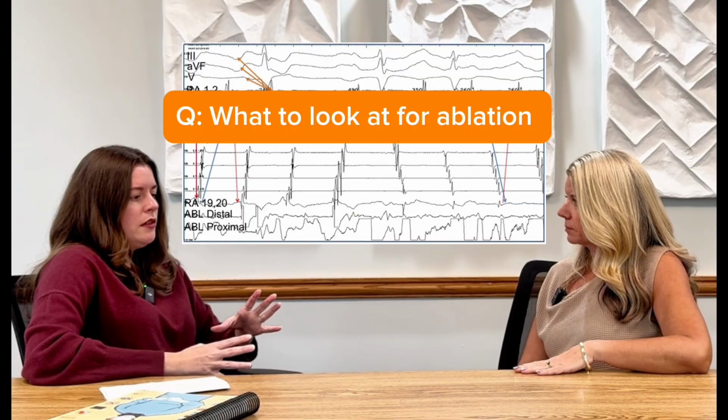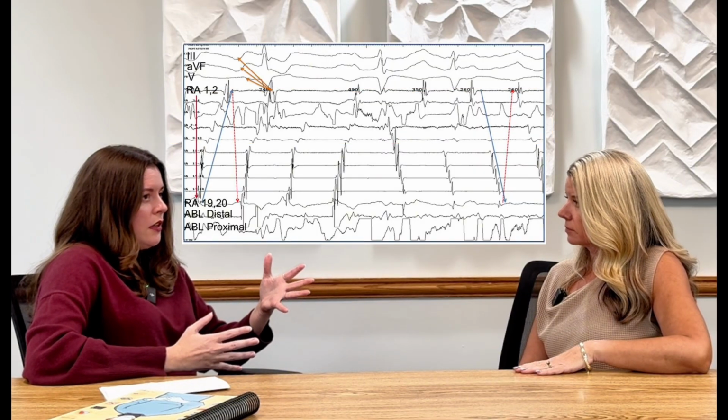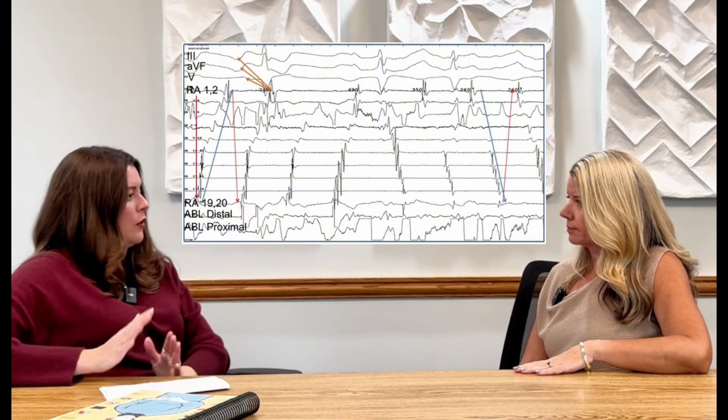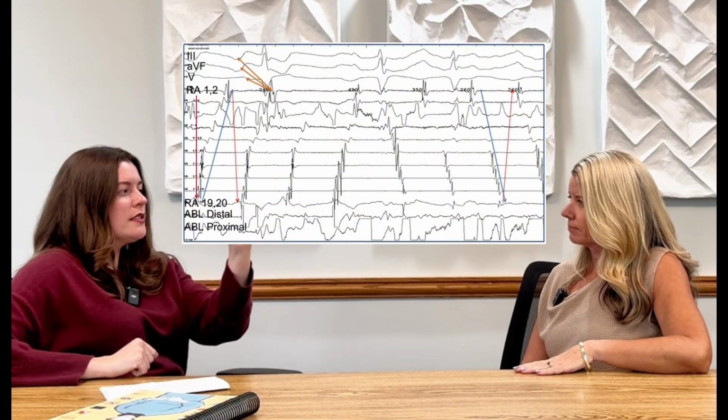Personally, I struggle the most with, of course, accessory pathways, but even flutter sometimes, post-ablation stuff and changing of direction and all of that. Is that something where you have to look at everything? Because with refractory periods and the early protocols, there is only one thing happening on one line. It's not happening everywhere, unless you really screw something up, or they go into AFib or something. But for the other types of things and ablations, do I have to have more of a directionality bird's-eye view? Because I feel like not one thing is happening.